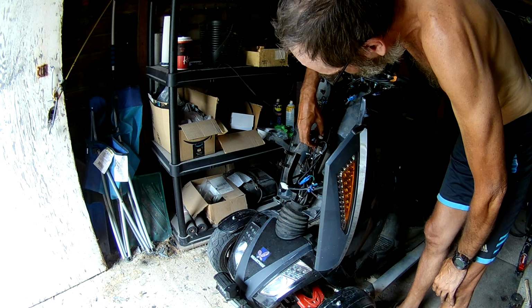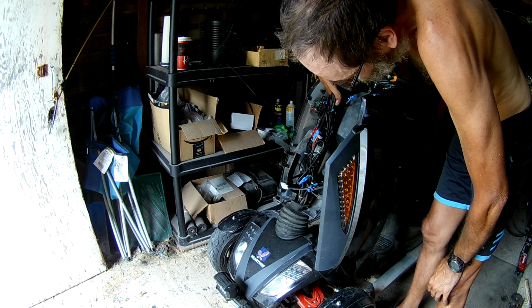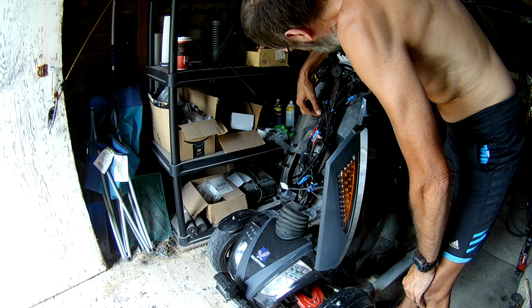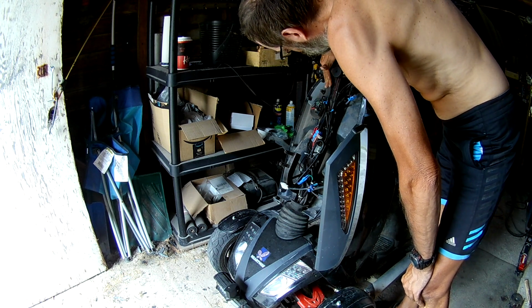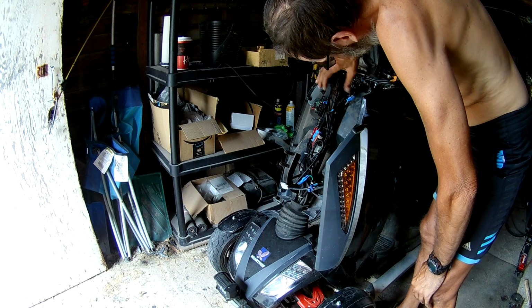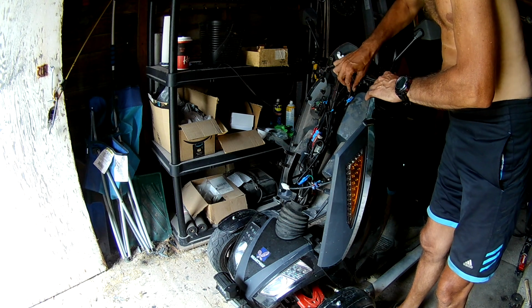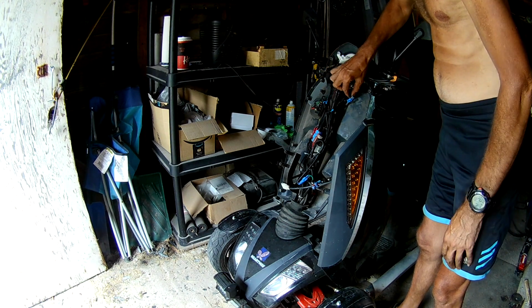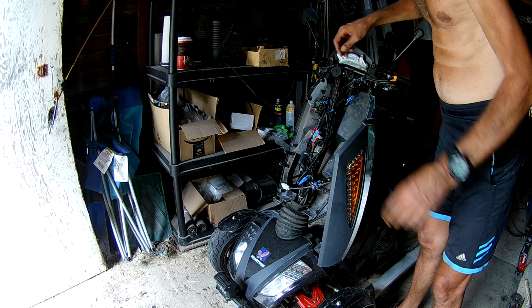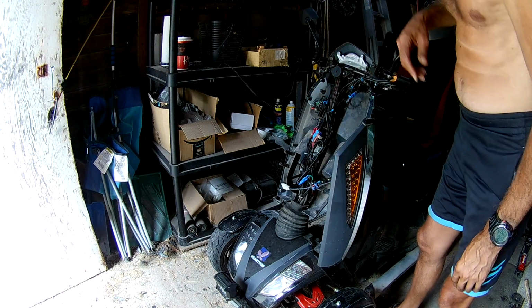Tiny wires on these things. Could be the rattle right there. Might have found my rattle. Yeah, maybe. I thought it was the relay for my bumper light, but it's not, because it's hitting plastic. I bet you that's it. Nothing to solve the problem, so it's got to be that wire underneath.